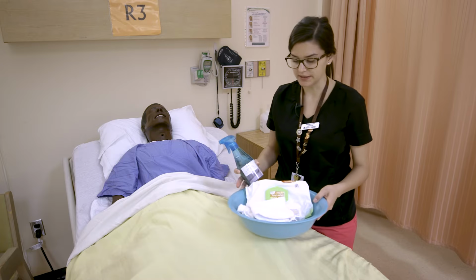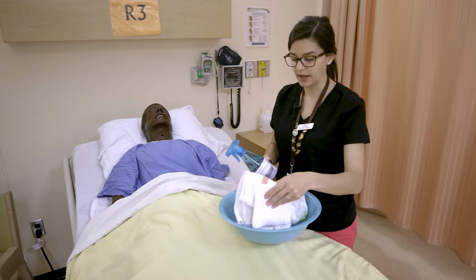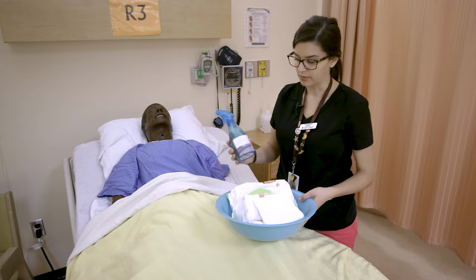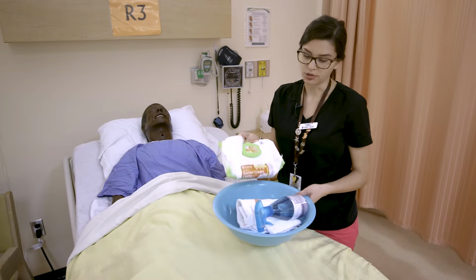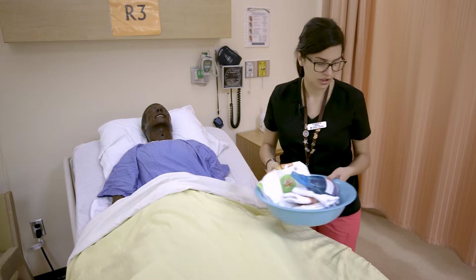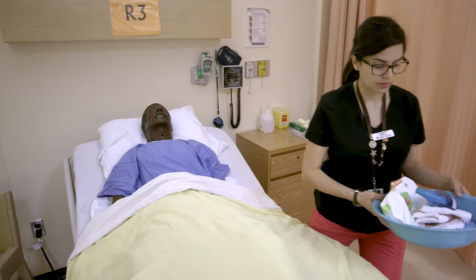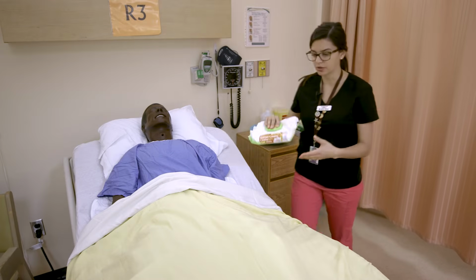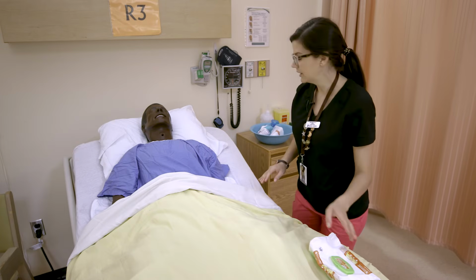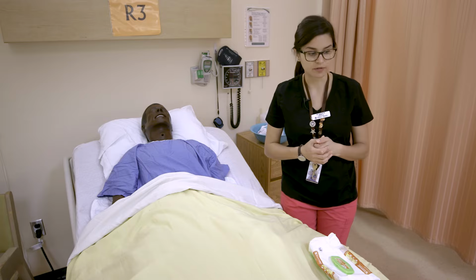and obtain the supplies that your facility uses, whether it's a basin and soap and warm water, whether they use the spray cleanser or the Sage or other brand of shields, for example here, the peri wipes. So we'll say we're going to use the wipes just to show, so we'll get those ready, and we're going to perform hand hygiene and grab gloves, of course, before starting.